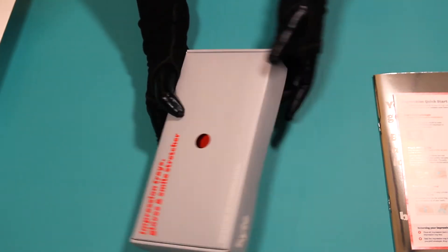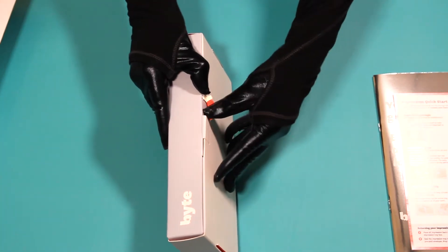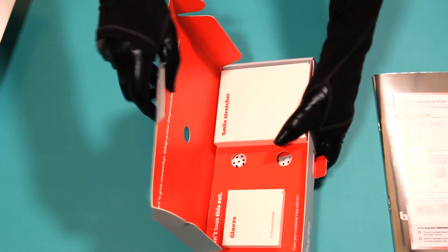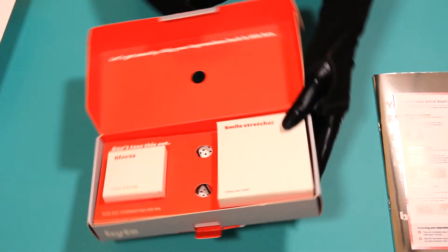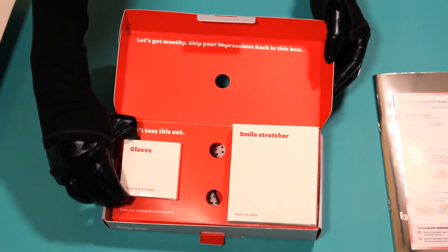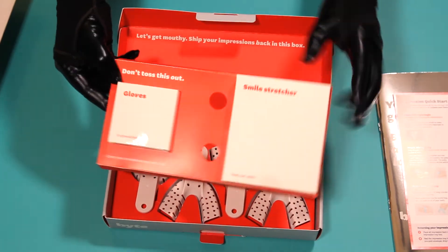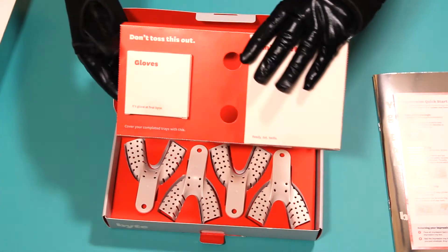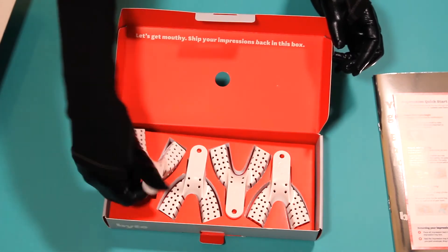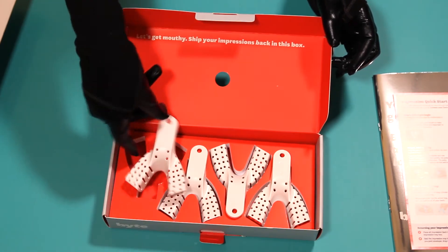And this is the actual Impressions Kit. Bite gave me complimentary gloves and a smile stretcher device for taking photos of your teeth. These are the trays to make your teeth impressions, and Bite gives you four trays so you can have two attempts.